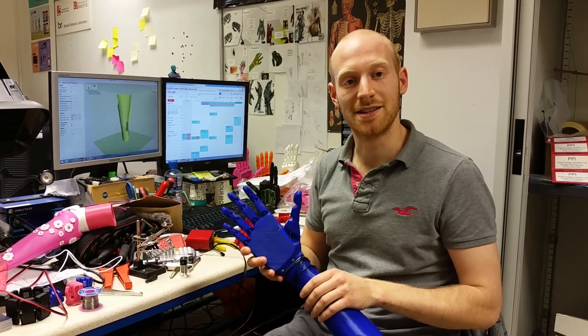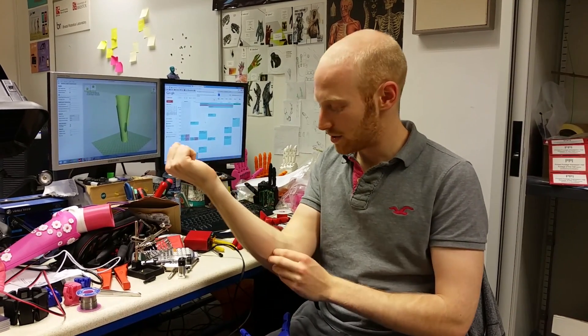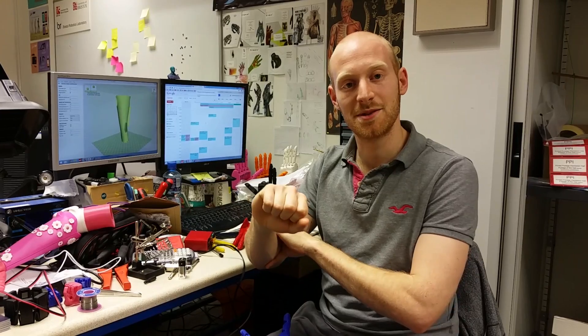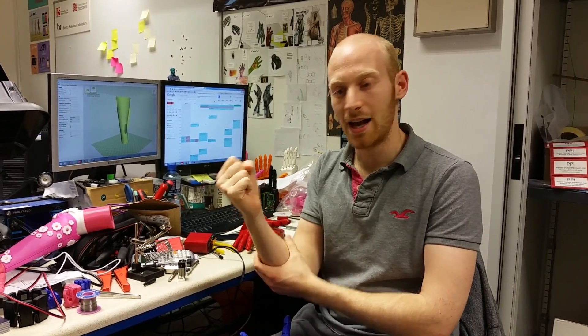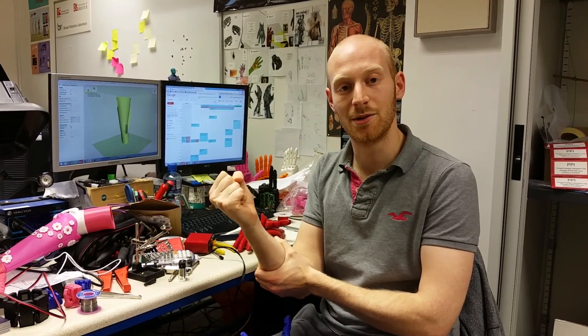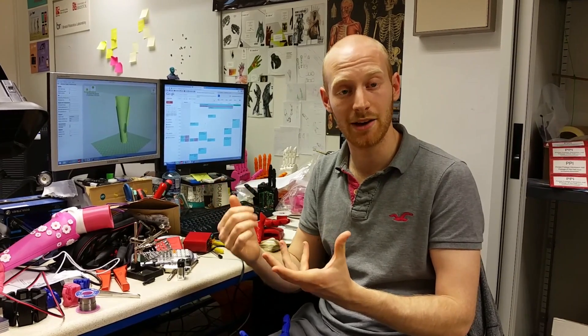This uses myoelectric sensors to operate. An amputee, despite not having their hand, still has the muscles in their forearm that operated their hand. We put electrodes on these muscles, and as they flex them they can make the hand move. This is a really intuitive way to operate the hand and gives them back a freedom of movement that they had previously lost, or were born without in some cases.